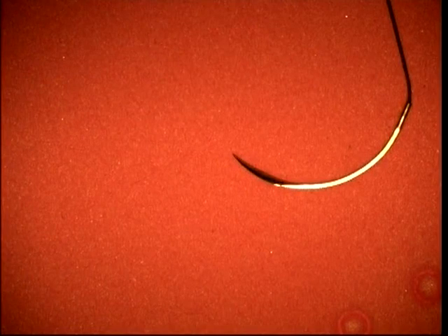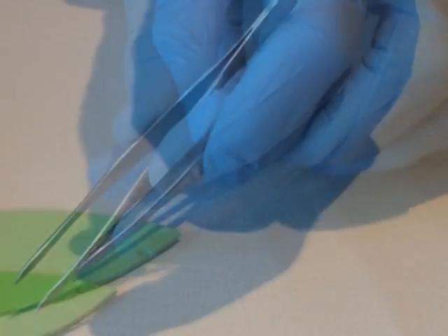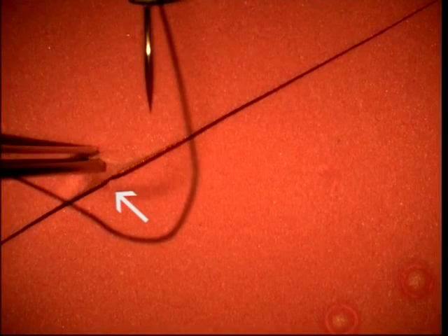So first we will use polystyrene foam and fairly large 4-0 silk suture. Hold the forceps like this and hold like this to evert the edges of the wound.